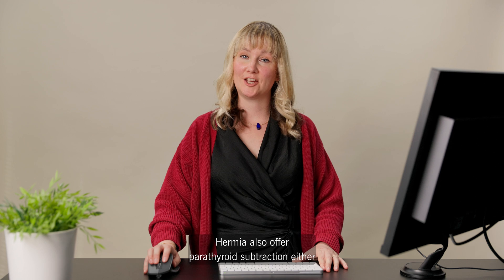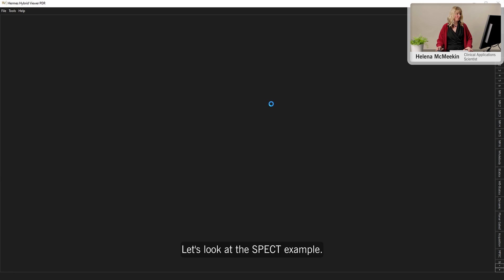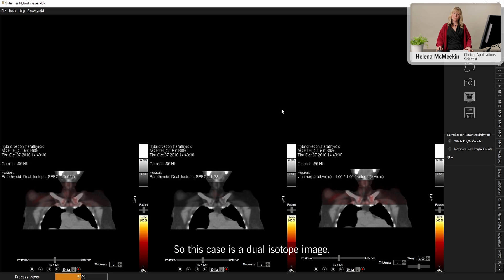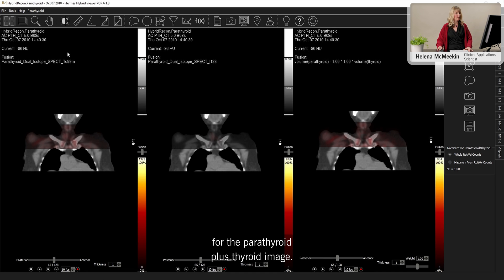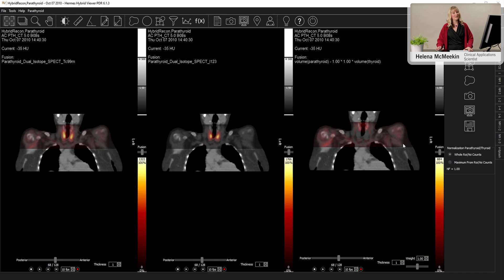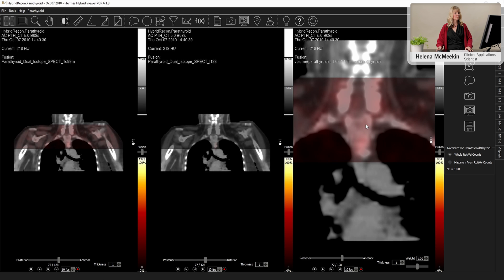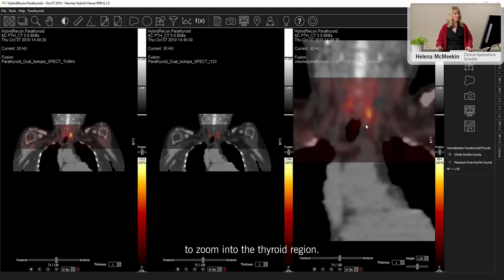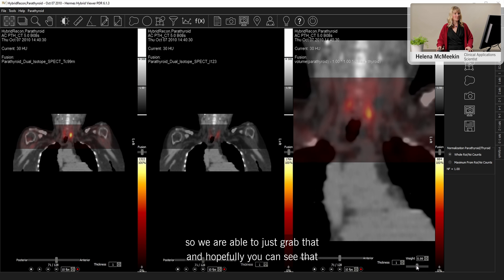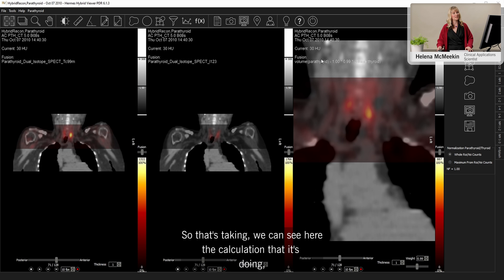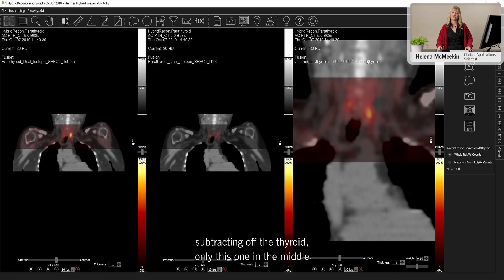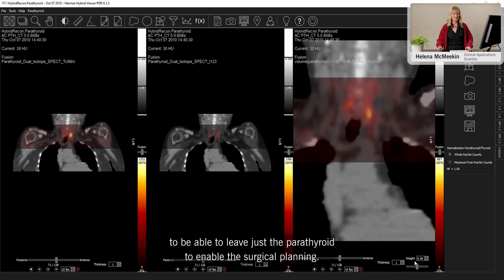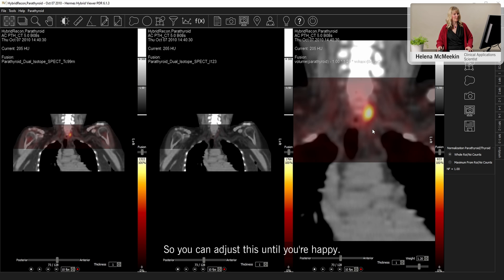Hermia also offers parathyroid subtraction either with SPECT or planar images. Let's look at the SPECT example. So this case is a dual isotope image. So we have I-123 for the thyroid and technetium MIBI for the parathyroid plus thyroid image. So we can see those two images loaded over here. This third view is the subtraction. Let's just make a zoom in on that image to zoom into the thyroid region. And then we have this really nice weight slider here. So we can just grab that. And hopefully you can see there in the image that the amount of subtraction is changing. So that's taking, and we can see here the calculation that it's doing is taking the parathyroid image, which is this one on the left, subtracting off the thyroid only, this one in the middle, to be able to leave just the parathyroid to enable the surgical planning.